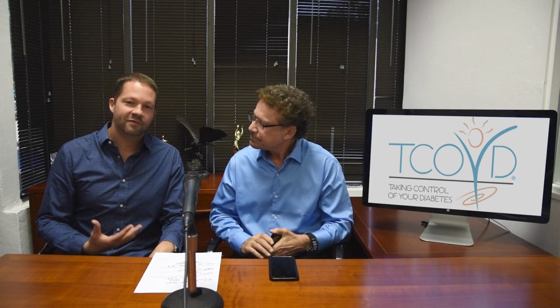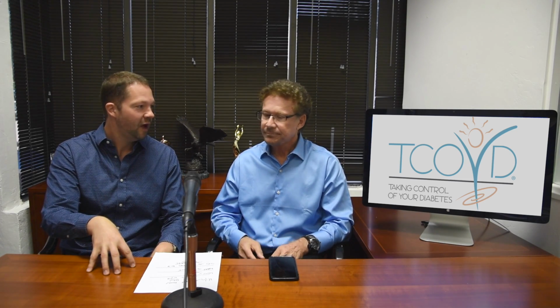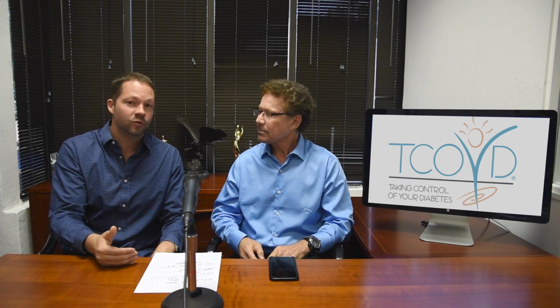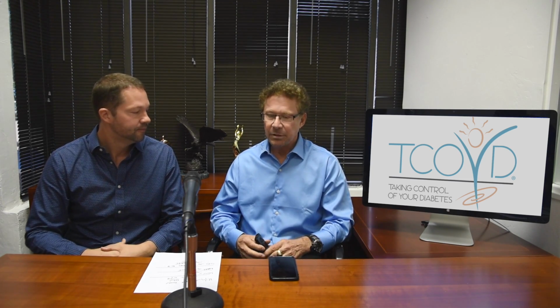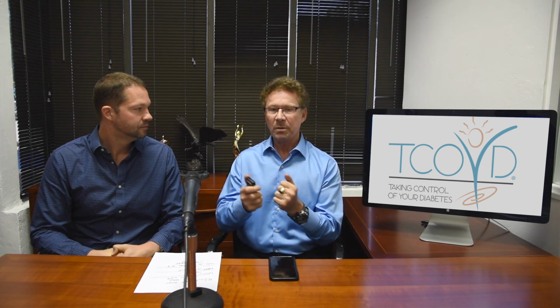Yeah. What about you? So I have mine set at 80 also. But I think, for people that have an extreme fear of hypoglycemia and like to run high most of the time, I might tell them, well, set it at 100. Give yourself a little bit more of a buffer so you feel protected. Yeah. And then you can adjust it if you need to. Yeah, you just remember, if you have hypo unawareness, that's the part you want to be cautious with.